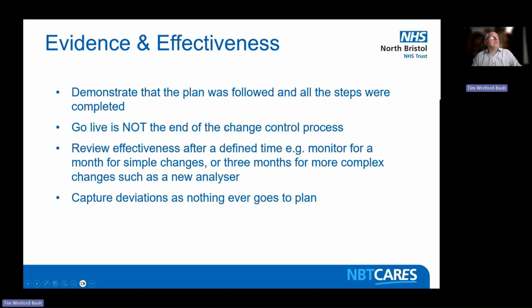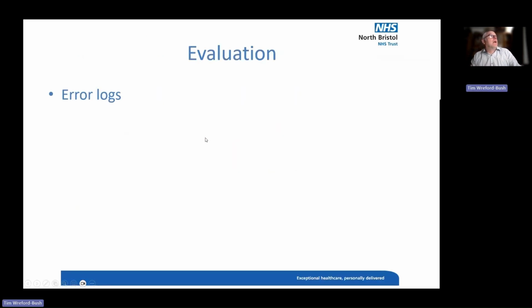So you need to capture those deviations. There's nothing wrong with deviations. Something might happen. Maybe your staff's gone off sick, for instance, and then you have to change the timeline. Just record it. It's a deviation. It doesn't necessarily mean it's a bad thing. And then evaluation.